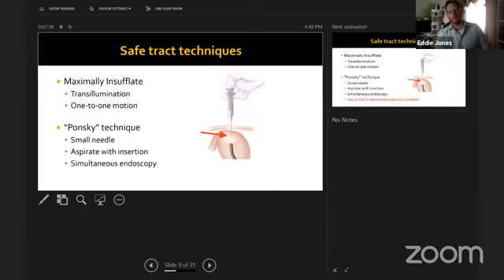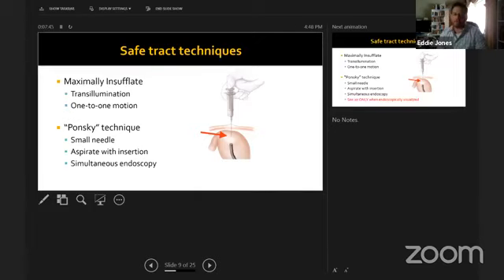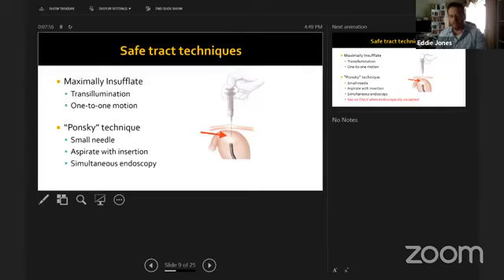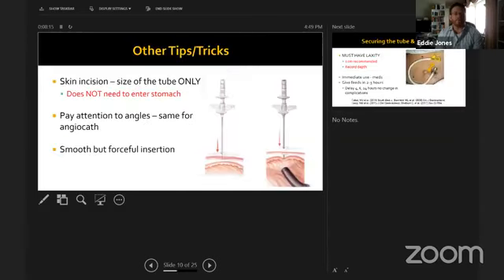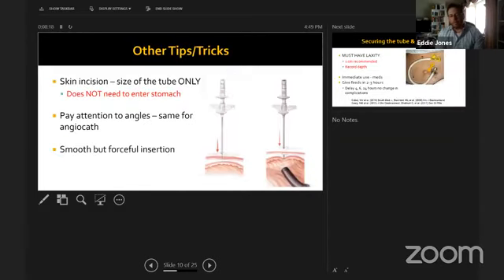The Ponsky technique uses a small finder needle with continuous aspiration to confirm safe entry. Maintain a perpendicular angle for the angiocath to match the finder needle trajectory. Use a smooth, forceful insertion to go straight through the stomach wall rather than tunneling along the serosa or submucosa. Replicate the same angle with the larger angiocath.